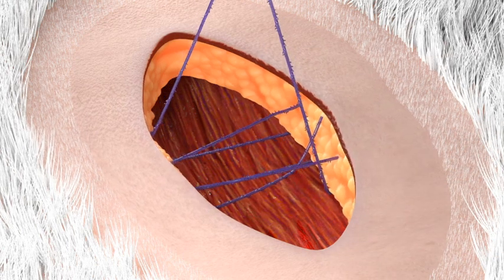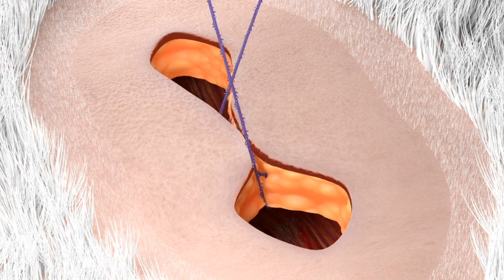Grasp both arms and cinch, approximating the tissue to the desired tension. This anchors the Quill device.